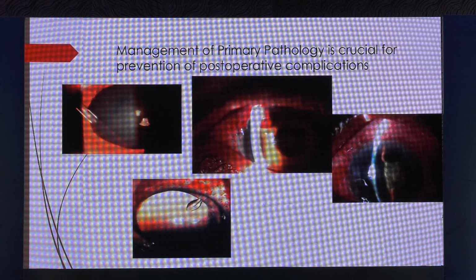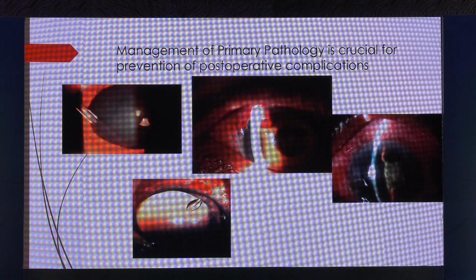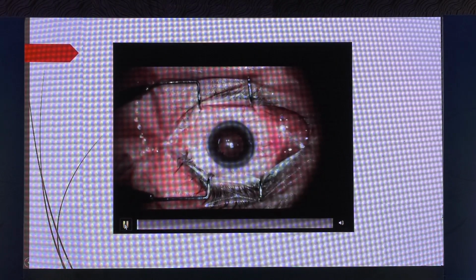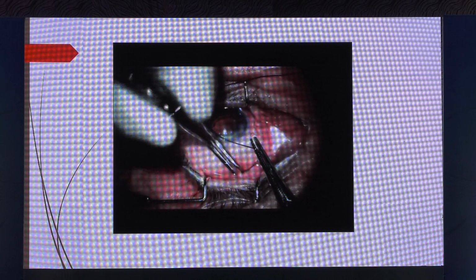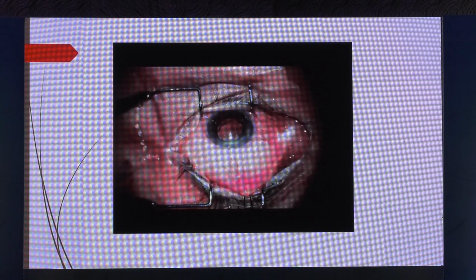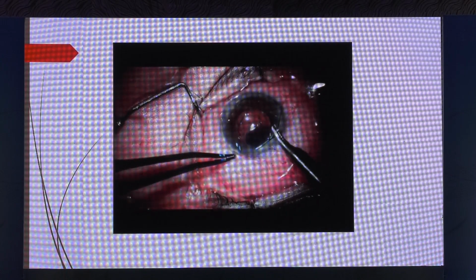Also, since most of these patients are having associated comorbidities, it is very crucial to know about the other comorbidities. If there is any vitreous or blood or excessive inflammation in the anterior chamber, then you have to first correct these factors, otherwise it can lead to blockage of the tube. Doing AGV is very, very simple as a routine case, and is much simpler than doing a non-valved implant, because you're just dealing with one quadrant. You are not handling the muscles.